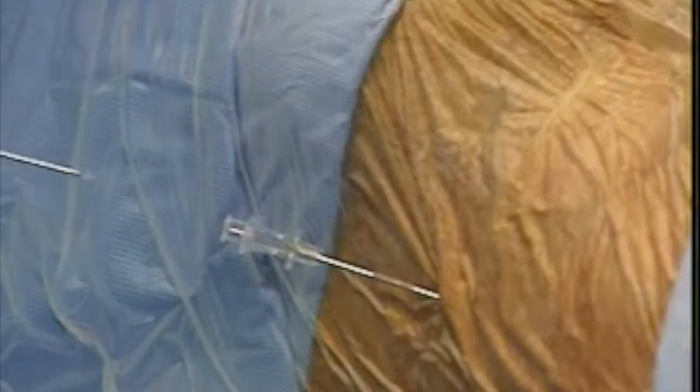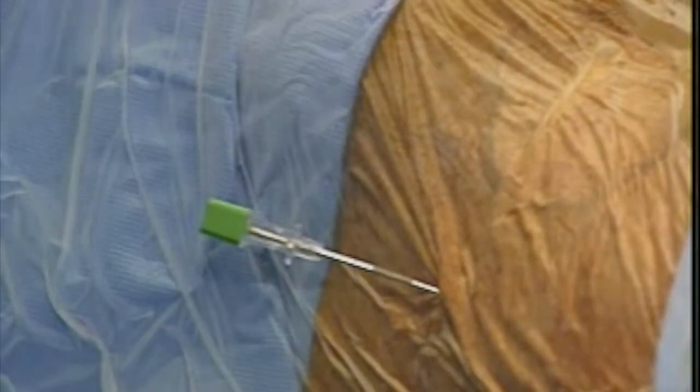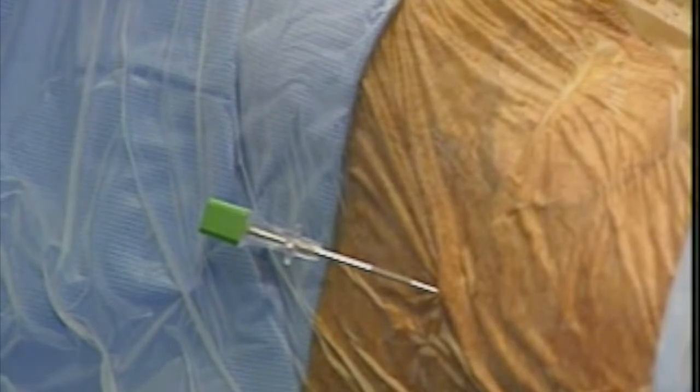Partially remove the needle stylet to observe cerebrospinal fluid backflow and confirm the intrathecal location. Then replace the stylet to prevent CSF loss.